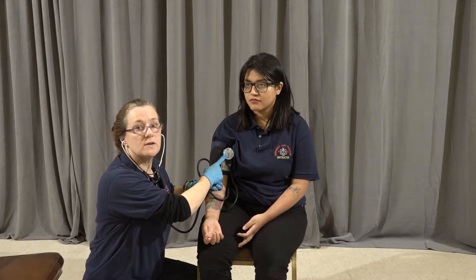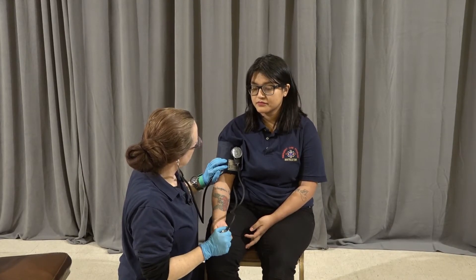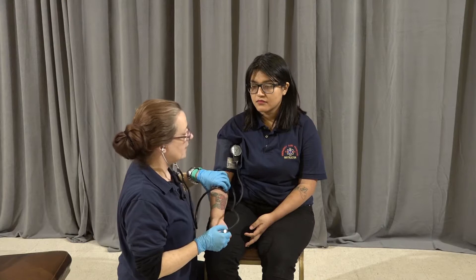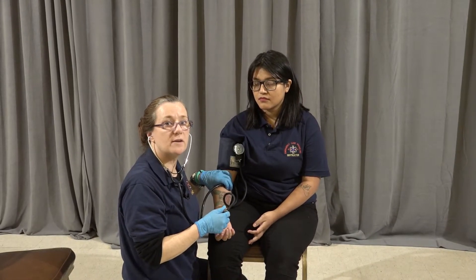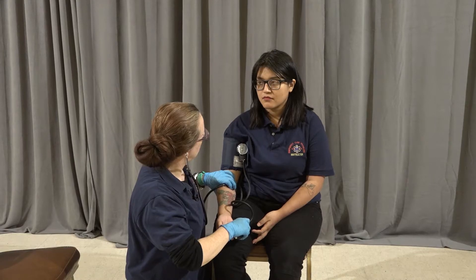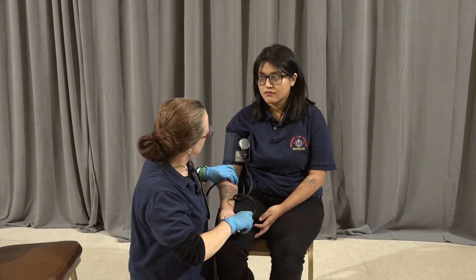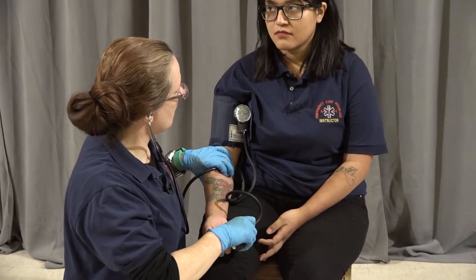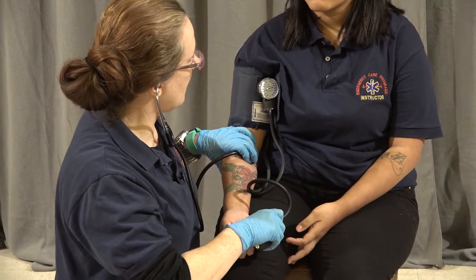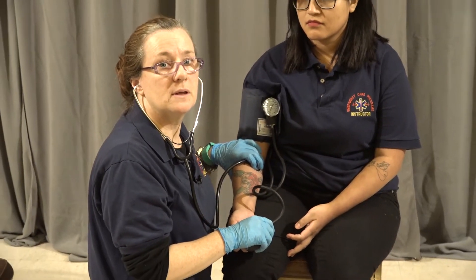I'm going to make sure I have a good view of the sphygmomanometer. I'm going to pump it up to about 160. If I can hear anything at this point, I would continue to pump it up until there was no sound. I'm going to release it and wait for that first sound. The first sound is the systolic blood pressure. As I continue to hear sound and allow air to be released from the bulb, the sound will eventually disappear — at that point I will have the diastolic. The systolic for this patient is 114, the diastolic is 60, giving us a blood pressure of 114 over 60.